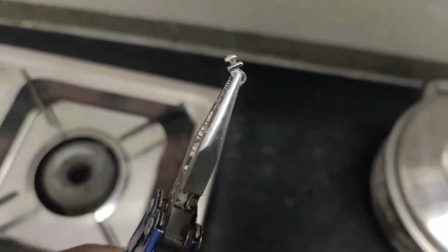I will show you how to fix it to the other glasses. Now I think you got the idea how I removed that broken hinge from those specs we needed. Now I am going to heat these hinges. Before that, it should be held properly. I will show you how I hold that hinge in this plier.